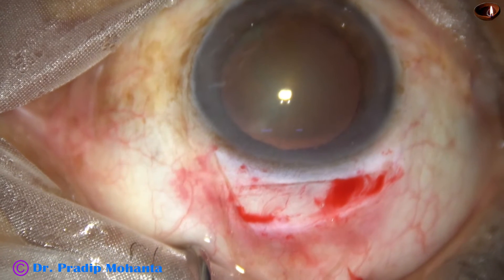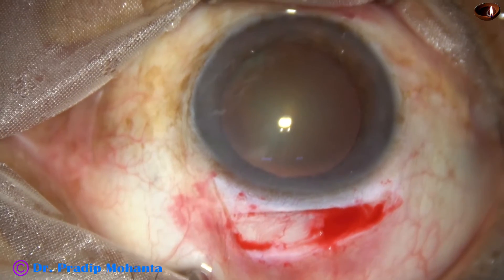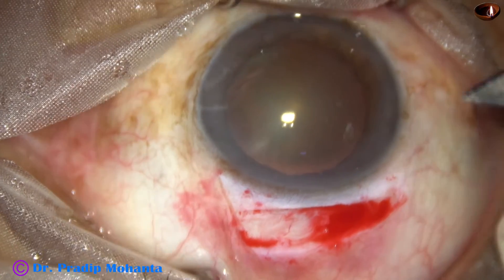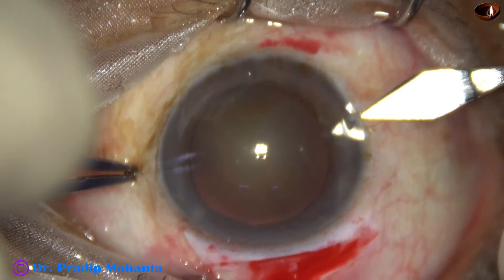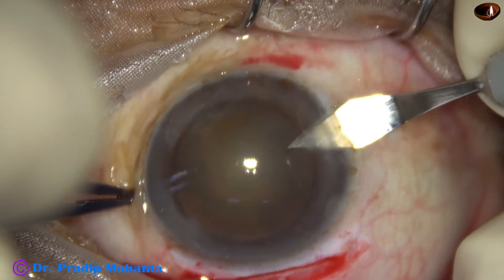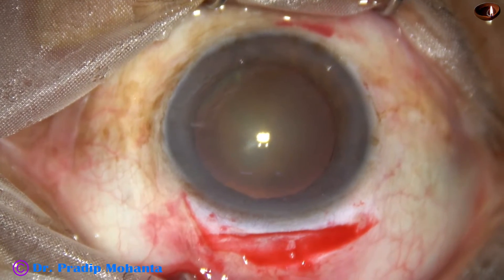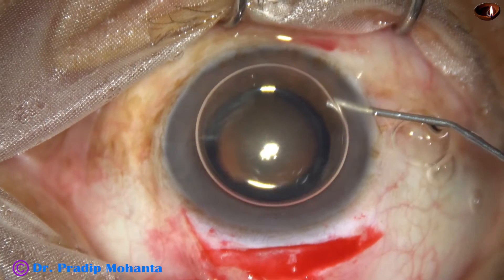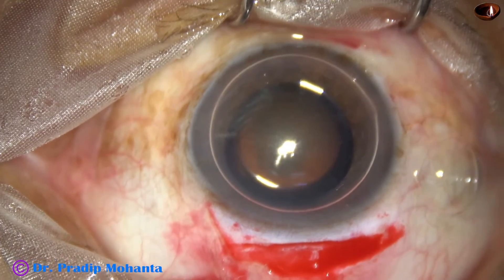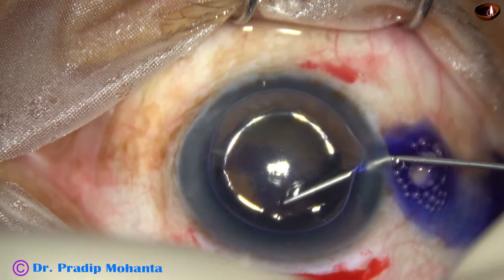A side port is made at around nine o'clock using a keratome. An air bubble is injected, and underneath this air bubble, trypan blue dye is applied to stain the anterior capsule.